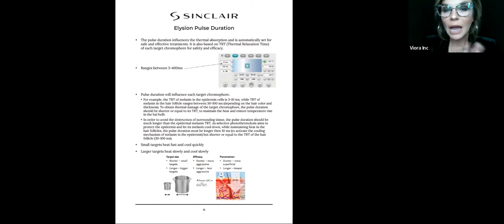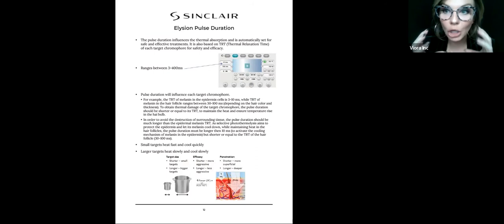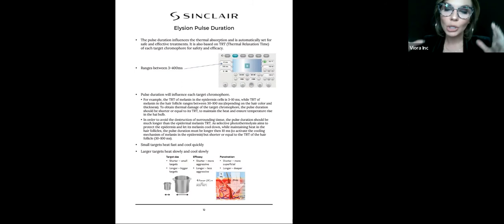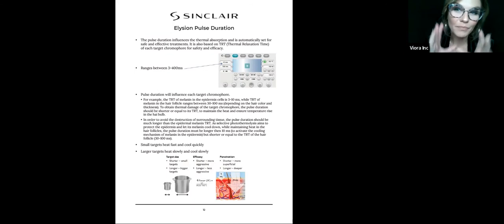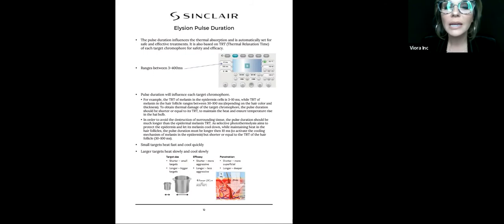On the opposite end, if you put in that they have darker hair and denser and thicker, then you'll get a pulse duration that's longer, because all of that hair holds onto heat for much longer because it's dark. There's a lot of chromophore. There's a lot of pigment in the area. So it will trap in heat and hold in heat, so it doesn't cool quickly. So we want to put it in slowly and not too quickly, because if we put it in too fast, all of those hair follicles, because it's dense, dark, coarse hair, will absorb the light too fast and will end up really targeting the skin around it and creating blisters. So it's going to be a much longer, slower pulse duration when the hair is dark and dense and coarse and thick.